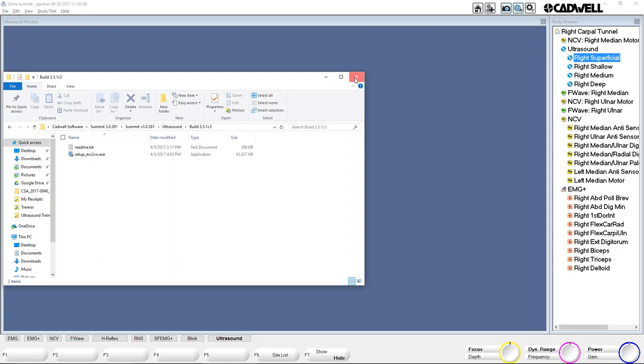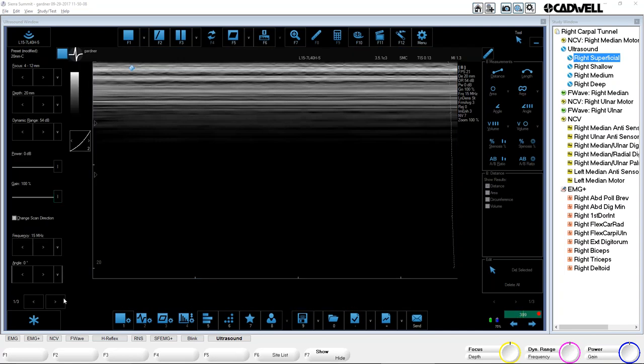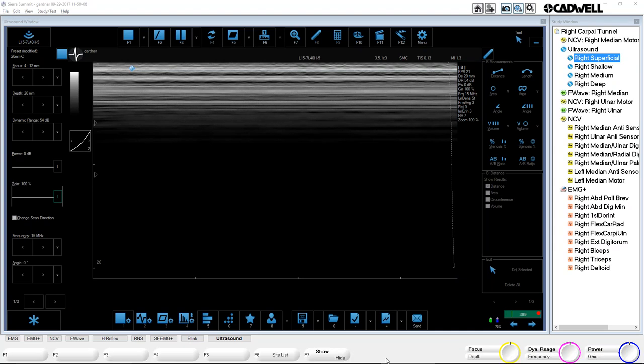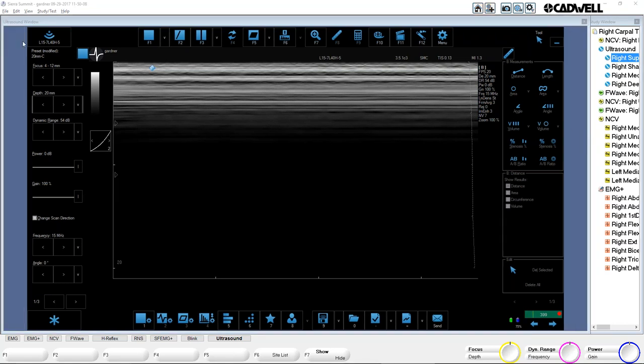The ultrasound software is always going to stay on top. So if you need to get into any settings or do anything else, F7 is hide, and that hides it so you can see any windows that pop up. That's kind of necessary to have that button, because of the behavior of the ultrasound software. Just make sure the ultrasound fits nicely in this window. I like it to take up as much of this blue screen as possible. I usually hide the toolbar down below so I have as much vertical and horizontal space as possible, and set the buttons to medium size. By doing those two things, I can usually maximize the amount of space it takes up.